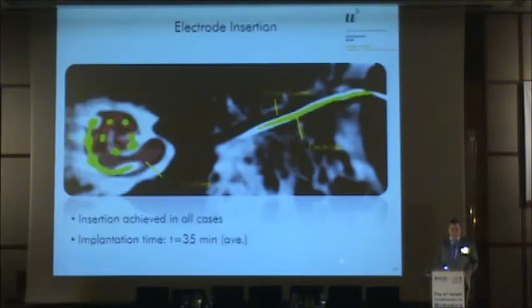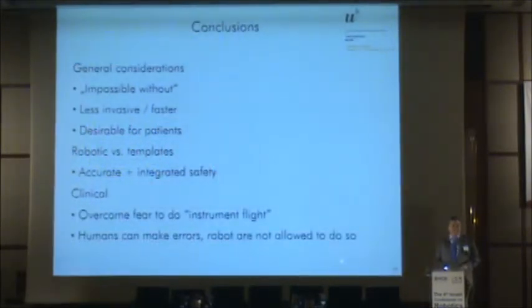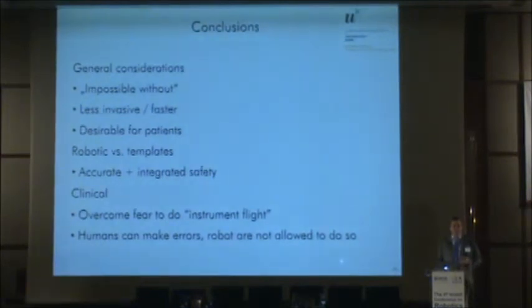And the idea is that in the end, the patient can be treated in a very light way. You don't have to have a strong pain medication because you don't drill a lot of bone behind the ear. The incisions are very small and the surgery time is very short. And we hope that in the future we can do this with young patients.